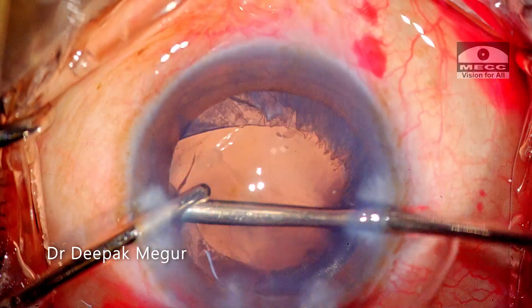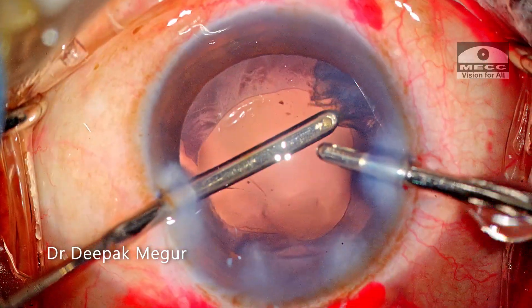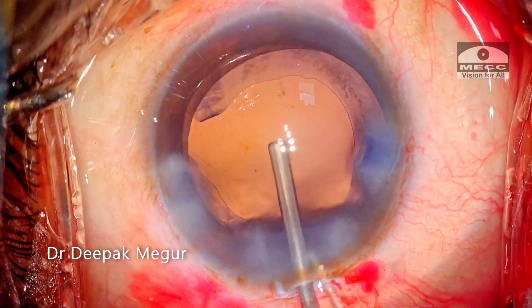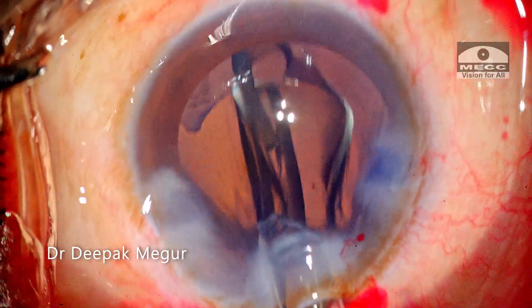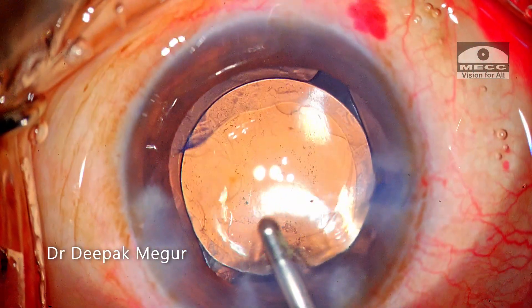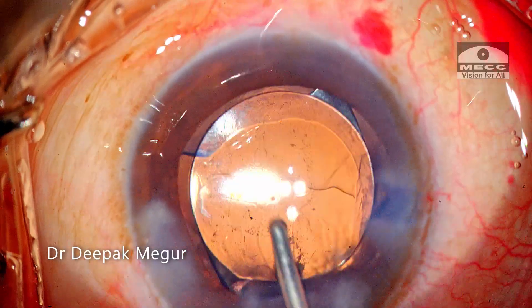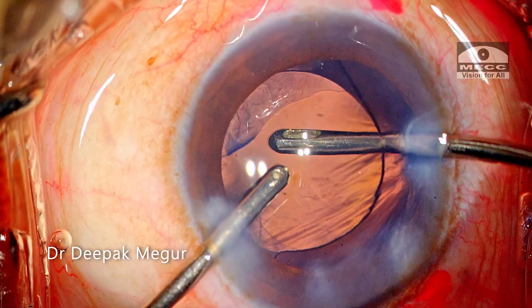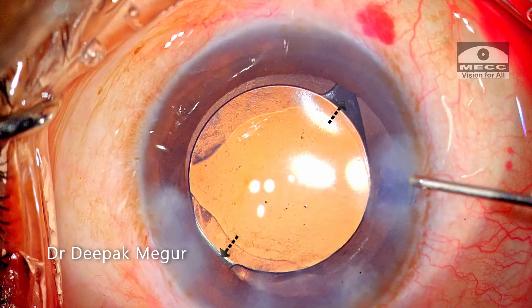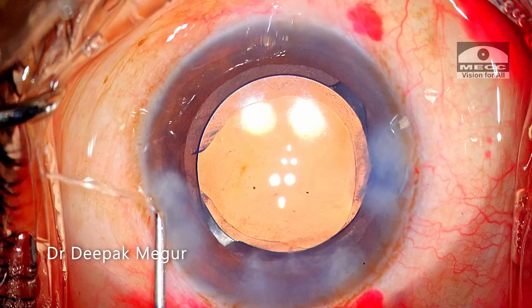There is very little cortex, which is then aspirated out. The OVD both in front and behind the lens is irrigated out. The irrigating cannula goes behind the IOL to irrigate out any trapped OVD. It is ensured that the haptics are away from the area of the torn rhexis before closing. The wounds are hydrated and the case is done.